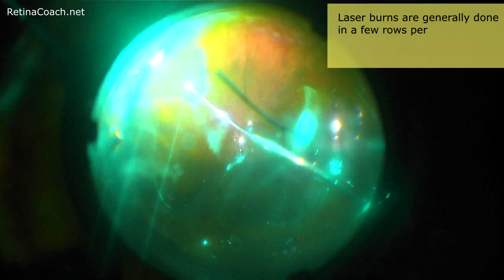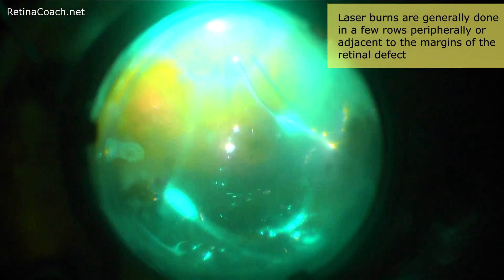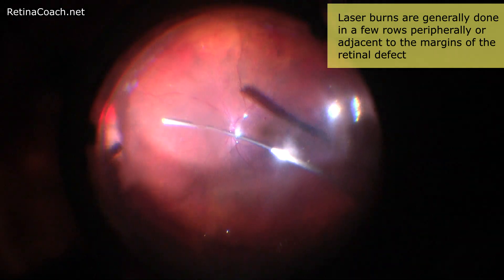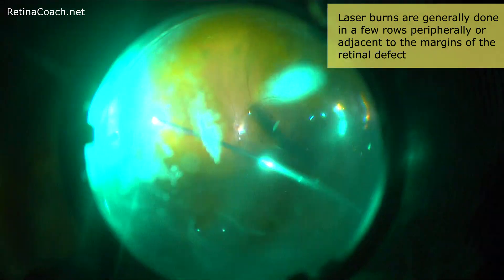Second, laser burns are generally done in a few rows peripherally or adjacent to the margins of the retinal defect.